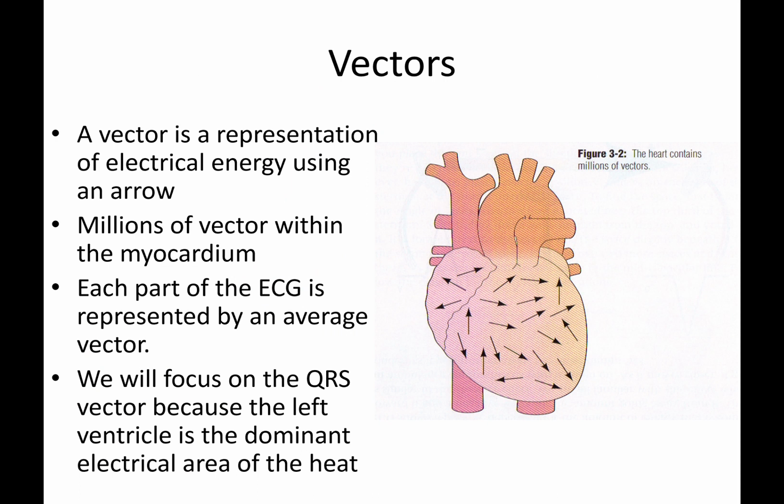Vectors. I've started mentioning it, and here we'll talk about it with a little bit more depth. Vectors are a representation of the electricity flowing through the heart. The idea is this: each cardiac cell has its own electrical flow, has its own focus.